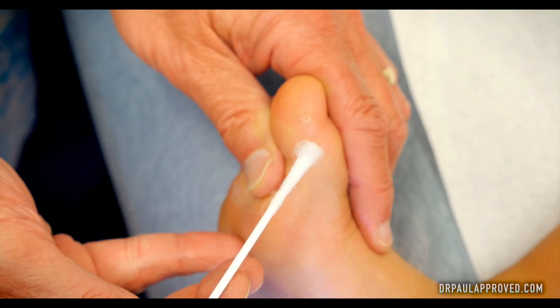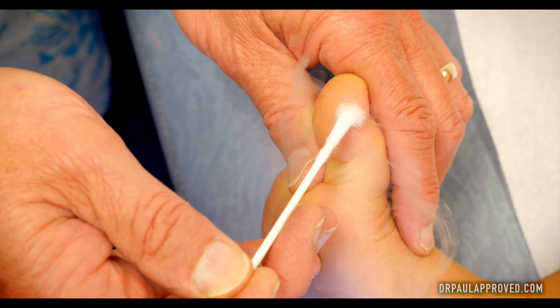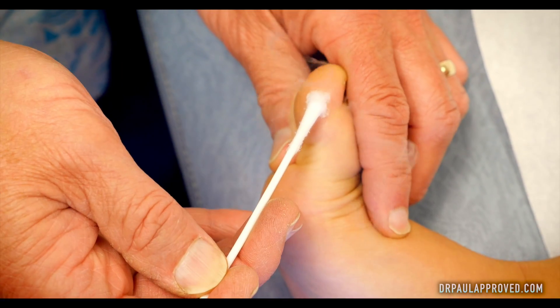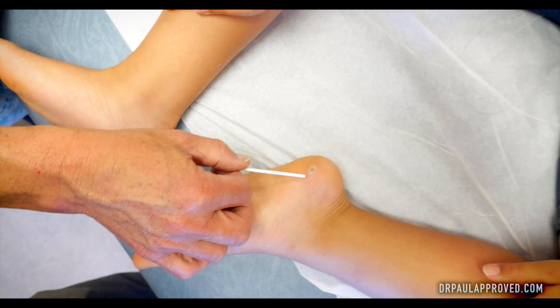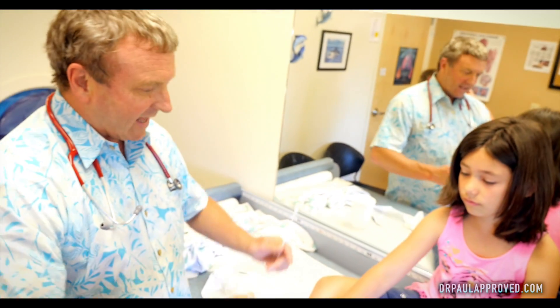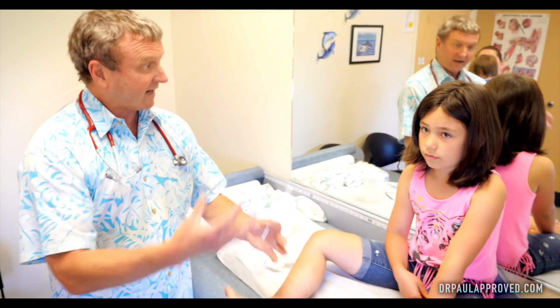This one will be real quick — we're almost done, because this one's just little. You're doing great. Toes have a lot of nerve endings, don't they? That hurts bad. I know — when I froze my wife's warts once she was yelping, ow ow ow. Sorry about that. When we freeze it, it's so cold that your body goes we've got to warm it up, and it sends extra blood flow to that area. That allows your immune system to interact with the virus and attack the virus.